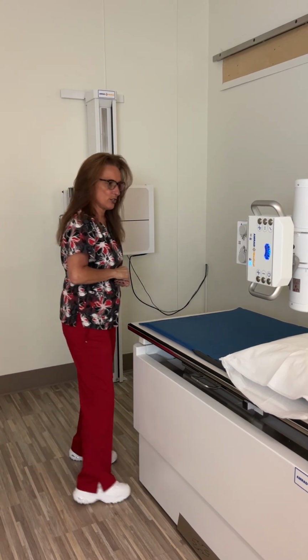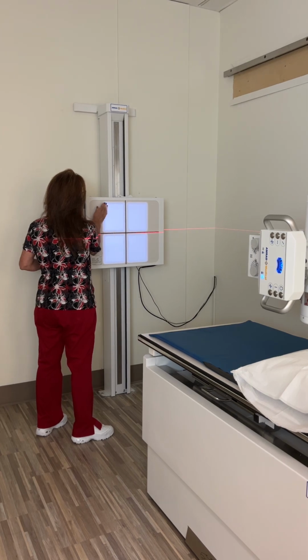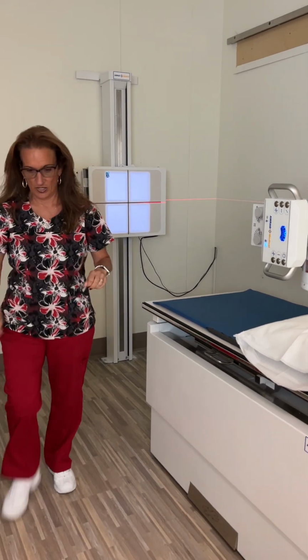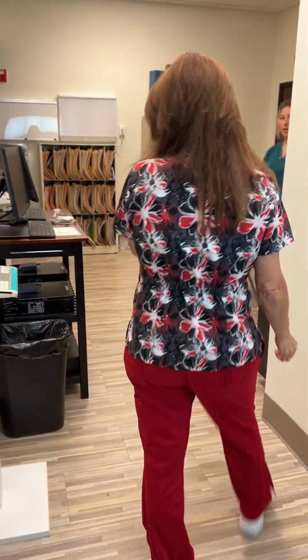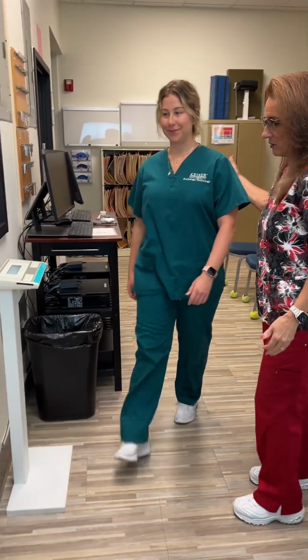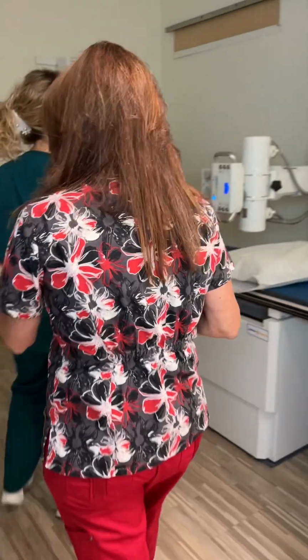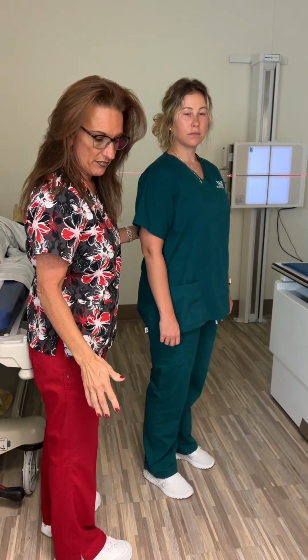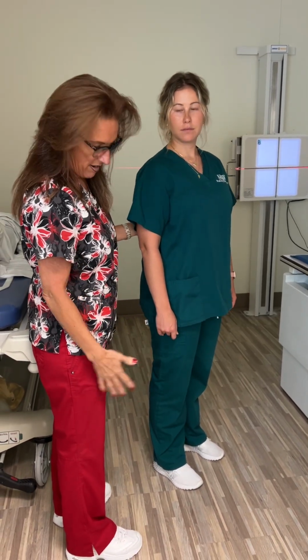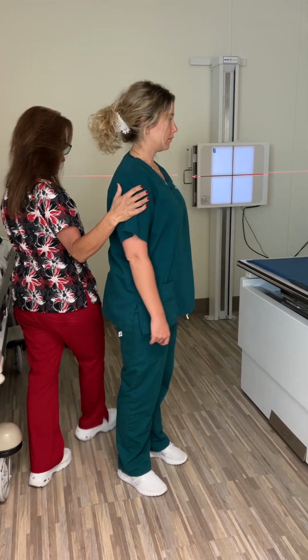My markers are super sticky. I'm going to put left marker on there, and I will get my patient, and then we'll get set for that. All right, Jordan, come on in. So in the other video, we explained history taking and changing the patient. So for this, she would have everything off. Shoes and socks would stay on, and she would have a gown on open to the back. No jewelry, no piercings, no nothing.